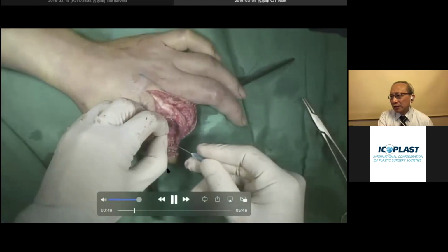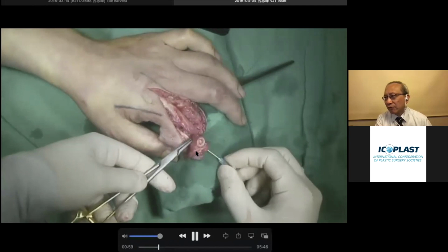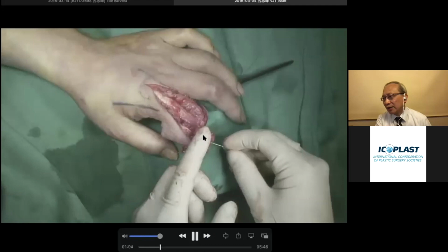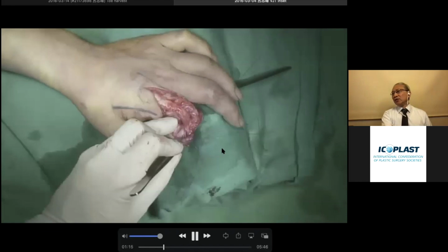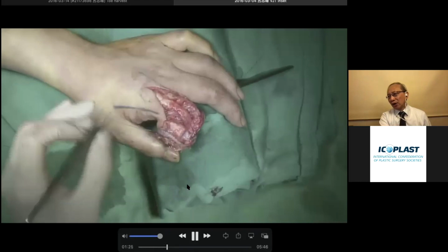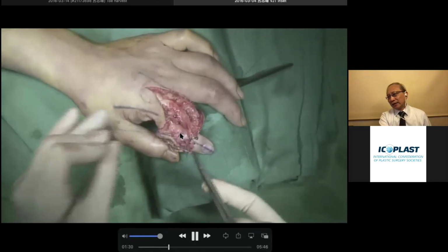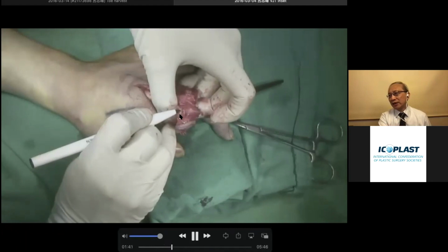And using the same drill hole, now I'm passing the 4-0 Prolene. I'm sorry. So this is a 4-0 Prolene suture from the plantar side, from the volar side to the dorsum. Another one. So with the Prolene suture, two heads of Prolene suture to the dorsum. And then I will suture through the periosteum, and to the lateral band of the toe extensor. Another side, periosteum, and the toe extensor. So when we tie this 4-0 Prolene, then the lateral band actually will be attached to the periosteum quite well.